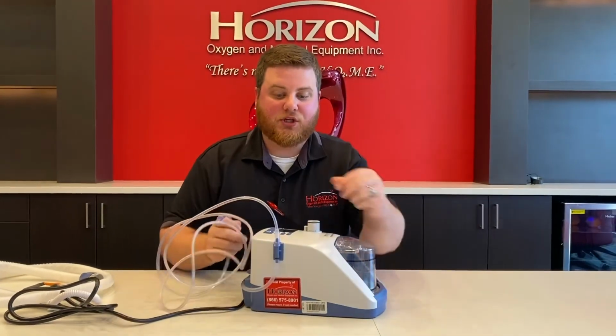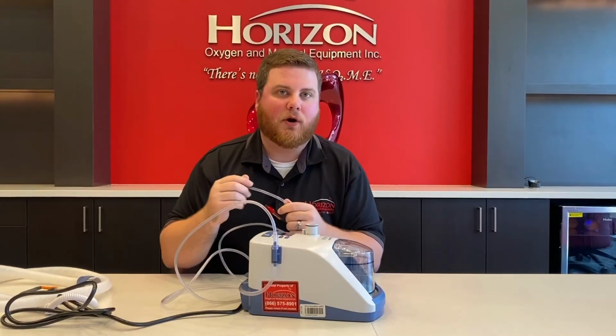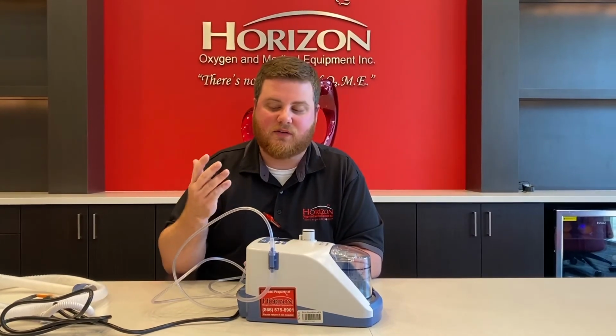Now remember, on the side of the machine is our oxygen tubing. Attached right now, I have an example of a 7-foot tubing. We always want to keep our oxygen tubing as short as possible to the patient, to this machine and to the patient. The longer that we have this oxygen tubing flowing from our source, which is typically a concentrator or multiple concentrators, the more likelihood there's to be developed of back pressure to that concentrator.